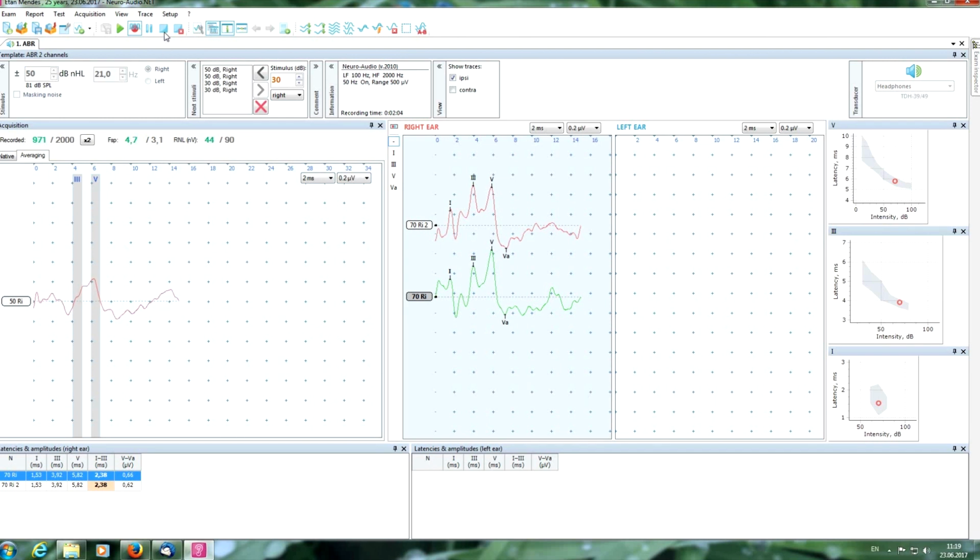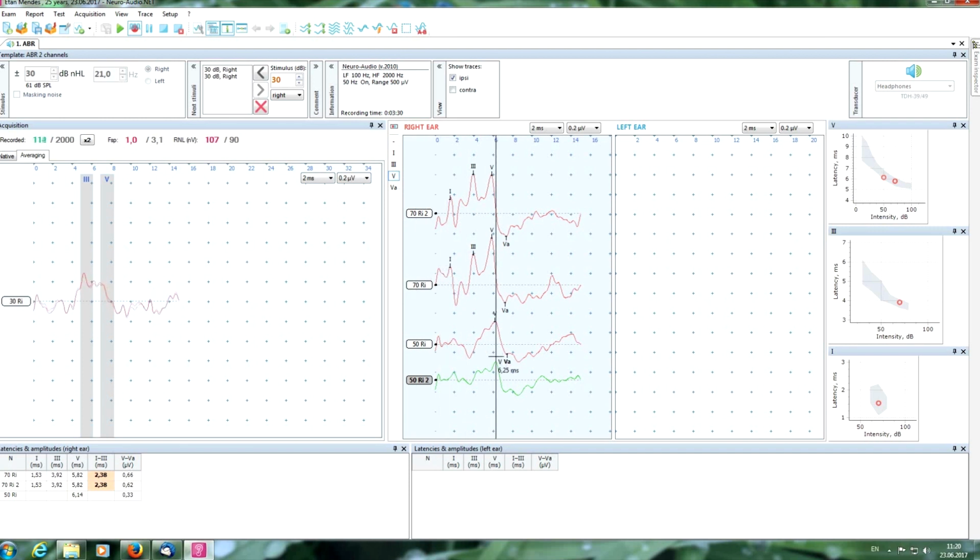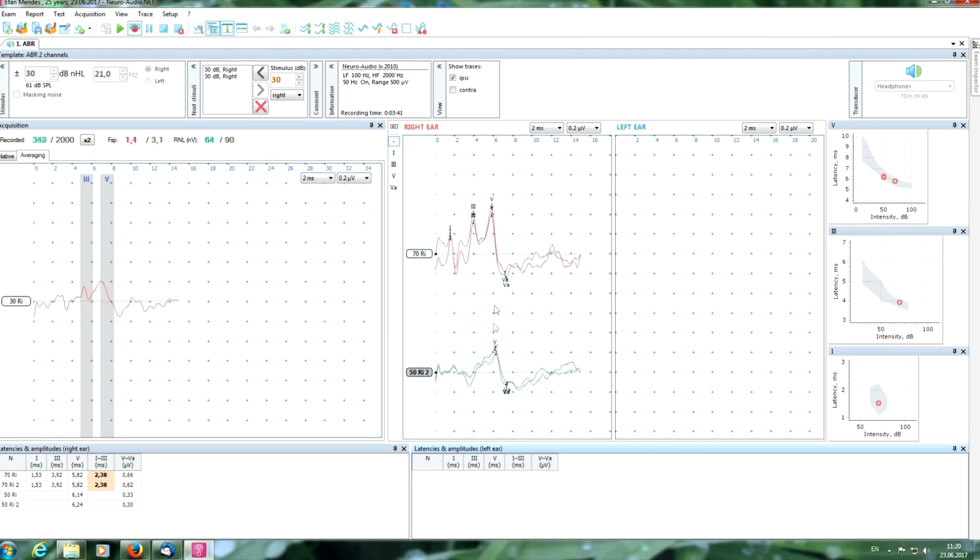Now we get another curve. At the lower intensity, we put the marker of the 5 wave and can see a new point here. It is normal latency. Now we are getting the second cycle response. Put the markers again. As you can see, when we decrease the intensity, the latencies of the main peaks become longer and the amplitude becomes smaller. It is normal.